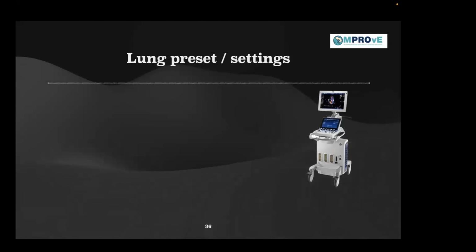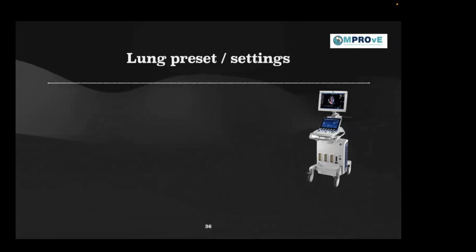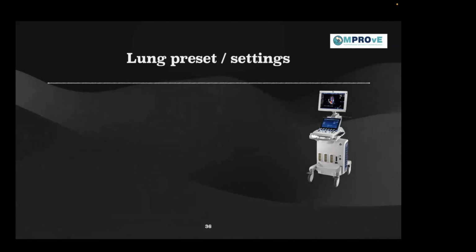Right. Now coming on to lung presets. What kind of a preset? The new fancier machines have started coming with the lung preset now, but the old machines are also good. They are better, actually, without the harmonics, which sort of clear all your artifacts. So we're going to discuss what kind of a setting we can use to make use of any ultrasound scanner to do a lung scan.